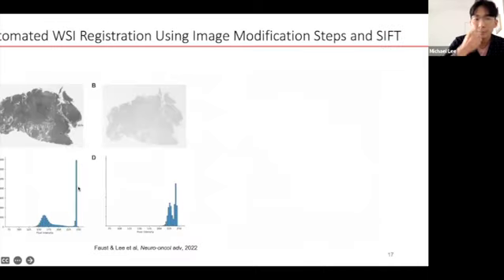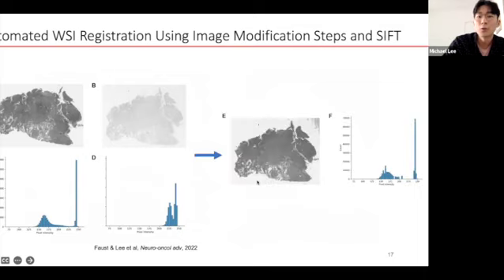And prior to SIFT, we had additional image modification steps as well, like converting them first to black and white images, as you can see in panels A and B. And from there on, also doing a pixel intensity normalization, especially because their pixel intensities are different. We would use histogram matching. And so now in A and B, the only differences are essentially the morphology of the tissues. Everything else like color and pixel intensity are normalized so that SIFT can operate on it much more smoothly.